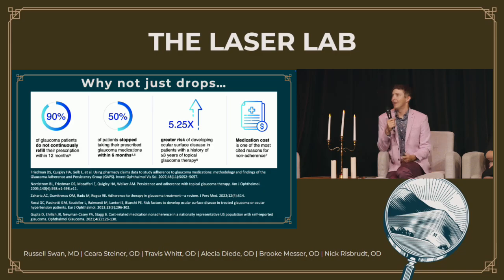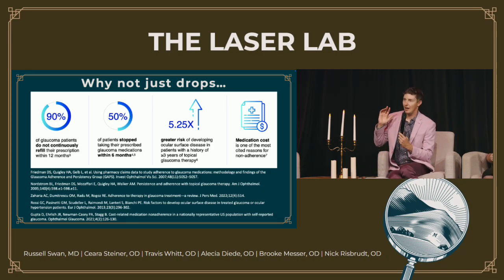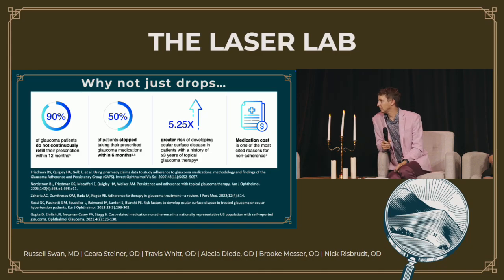So I'd love to get your thoughts on SLT as primary treatment over drops and how you talk to patients. A newly diagnosed patient comes into your clinic referred for mild glaucoma, and they haven't started drops, they haven't done a laser, they're asking you, hey, what should I do as first line therapy?